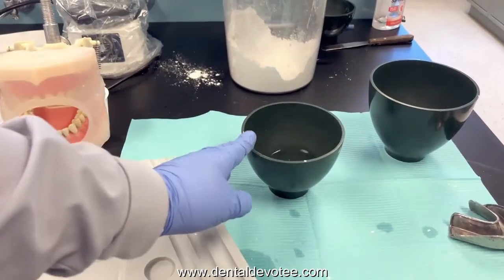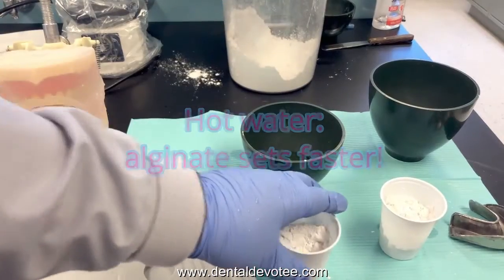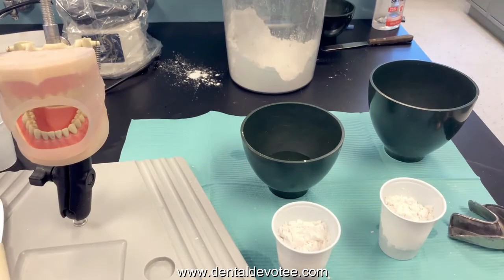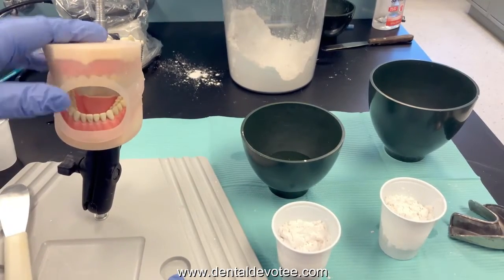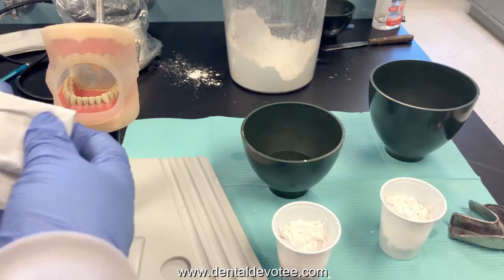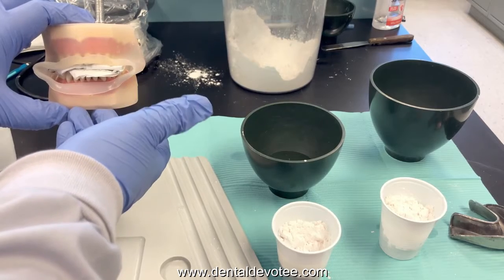For best results use room temperature distilled water. Alginate is also temperature sensitive — if you use hot water it will set up faster and you'll have less time to mix it. If you use cold water it will take longer to set, giving you more working time. With room temperature water you'll have about 30 seconds to mix and 30 seconds to load it into the tray and position it in the patient's mouth — a few things have to happen in a very short time. You need to dry the patient's teeth using an air water syringe just before you insert the tray, or have them bite on some gauze.